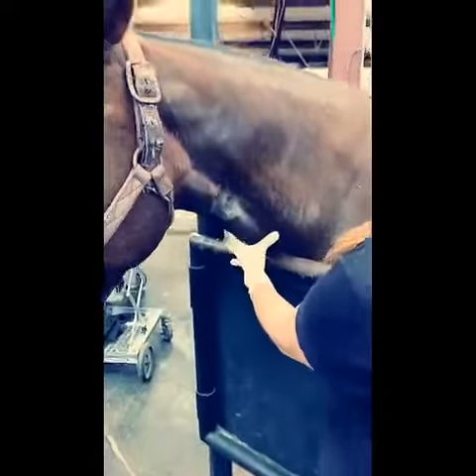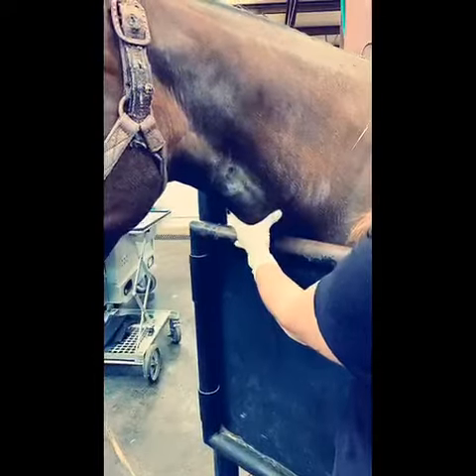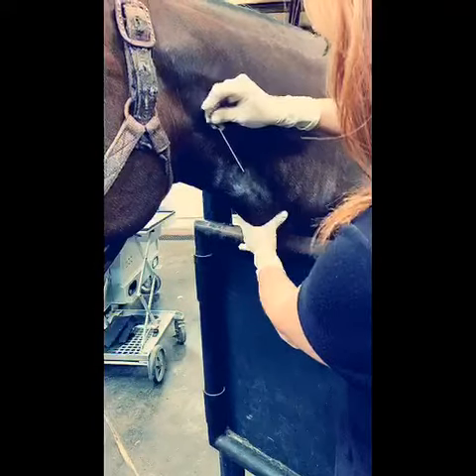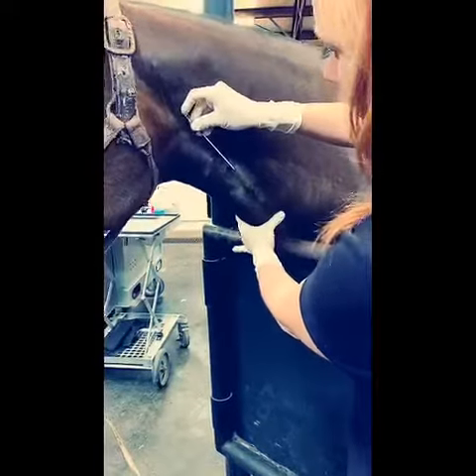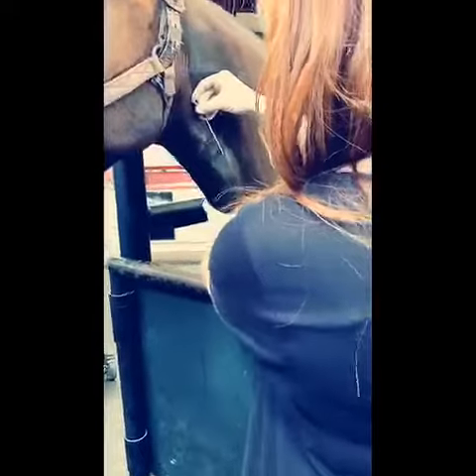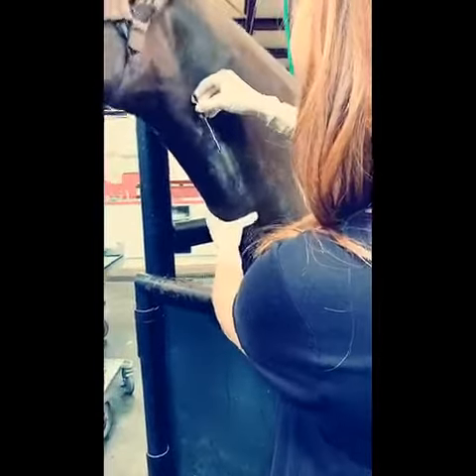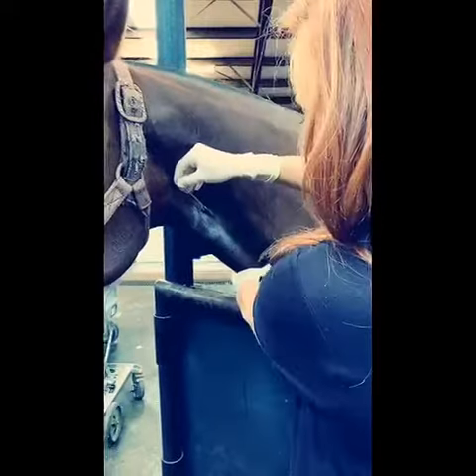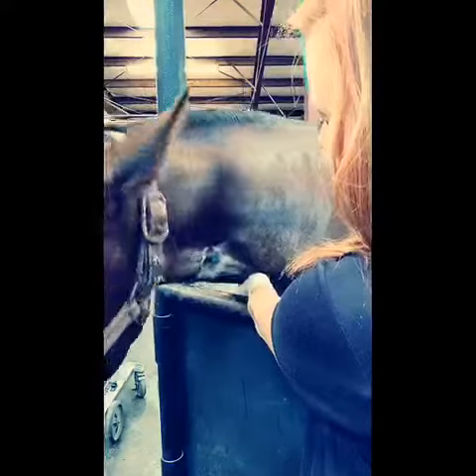I'll apply slight pressure to my jugular vein, noting jugular fill. I'll approach the skin at a 45-degree angle, entering into the skin and into the jugular vein. Once I note blood flow through my catheter, I'll insert my stylet a few more centimeters, slide my catheter off, and hold off on my jugular vein until blood flow is noted.